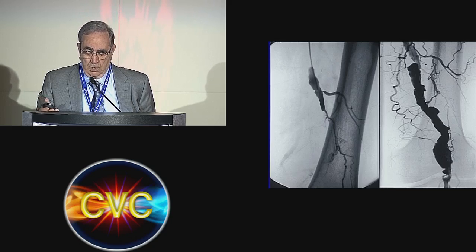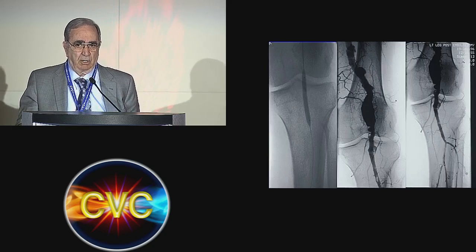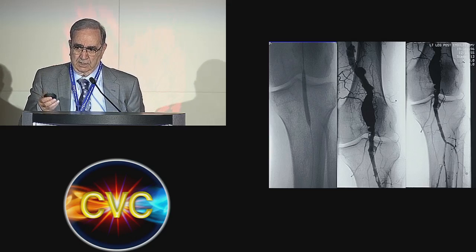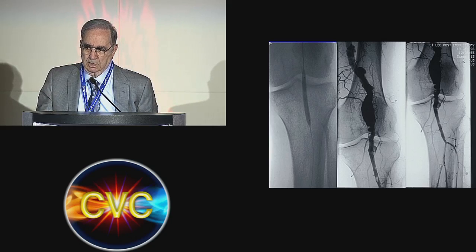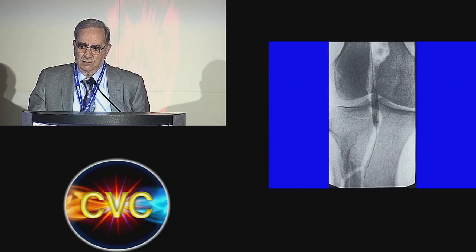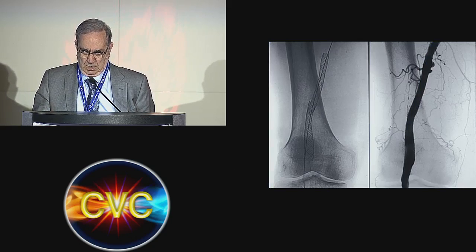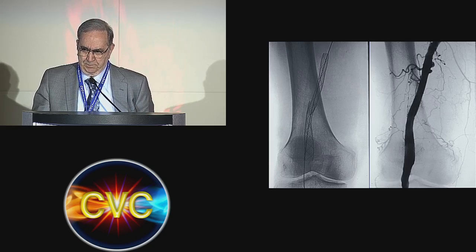And he did very well, except that he came back the next year with thrombosis of the other popliteal artery. The left side had been dilated at that stenosis, which made that popliteal less symptomatic. He came back with thrombosis of the right side. As you see, we did lytic therapy. We dilated that stenosis, and we put a Wallgraft in him.